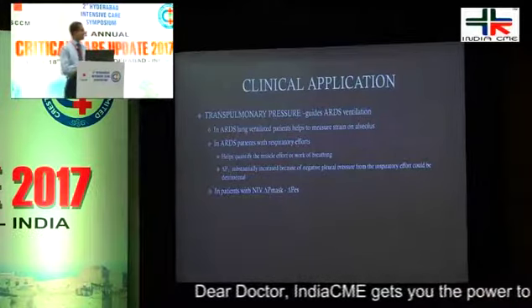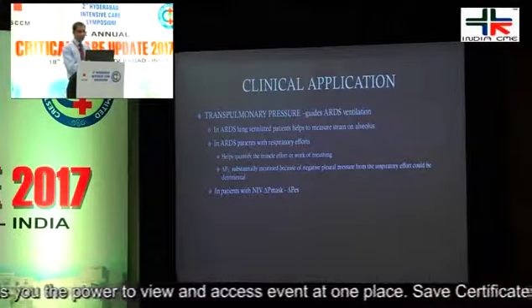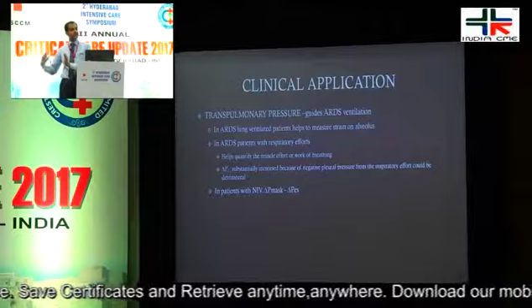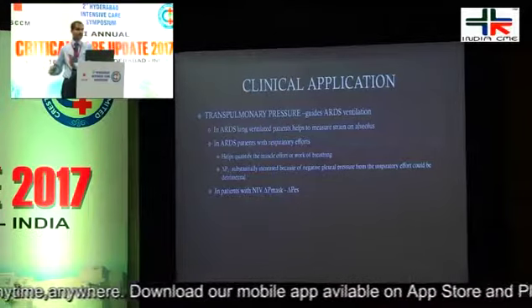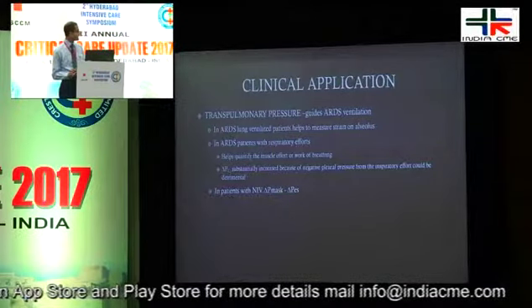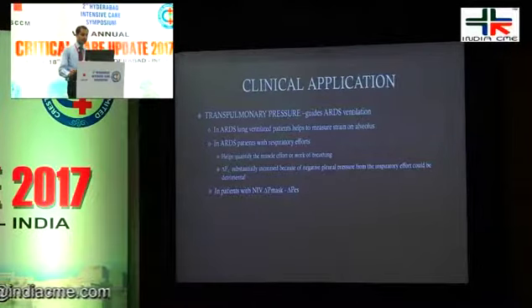So, essentially, in a patient who is having spontaneous breathing, measuring the transpulmonary gradient will incorporate this factor as well, as to how much attempt or negative pressure is happening in the pleural space, which is measured by the esophageal pressure monitoring, and therefore that will give you an idea of the gradient. That is why the concept of transpulmonary gradient is very important, and that is how the clinical application of esophageal pressure monitoring comes into play.